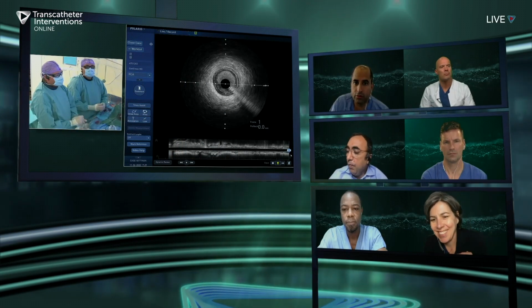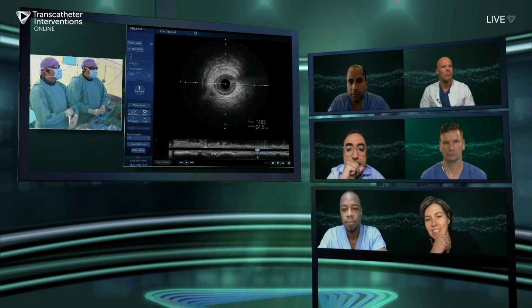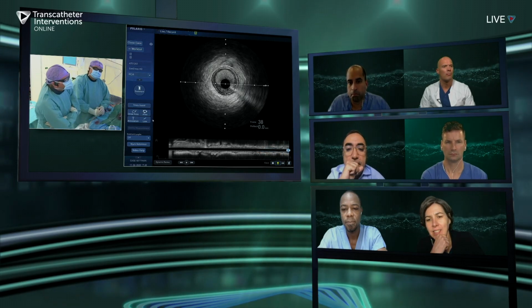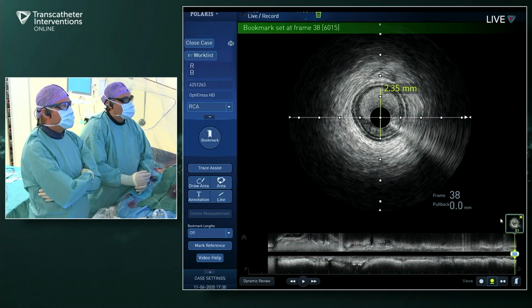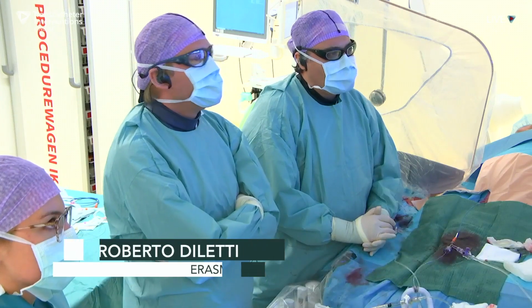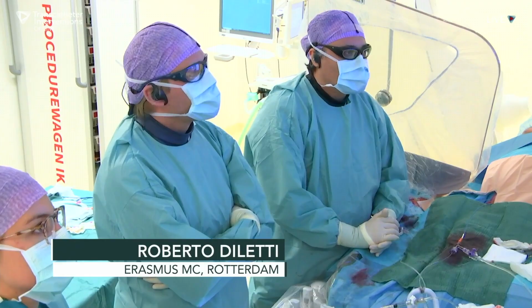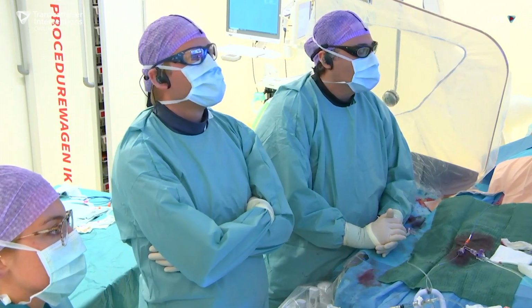Leipzig, so just tell us really quick what is your ballooning and stenting strategy, and an amazing demonstration, by the way, to get that epicardial. Yes, thanks a lot. So we will go for predilatation, of course, in the proximal part. I think I haven't seen exactly what the diameter is proximally, but I think it will be around 3.5 stent at the proximal part.